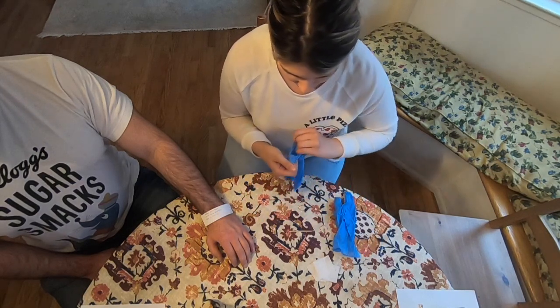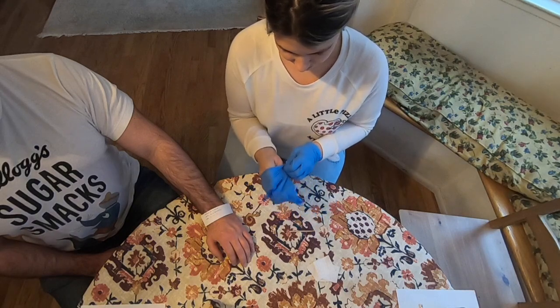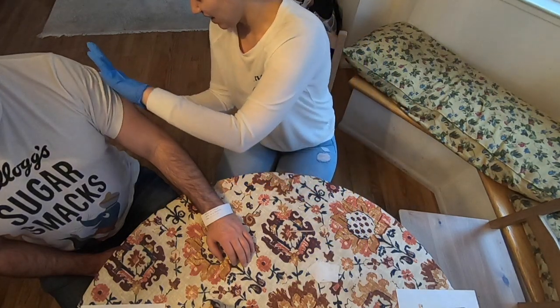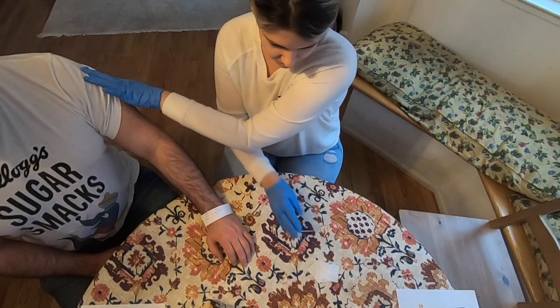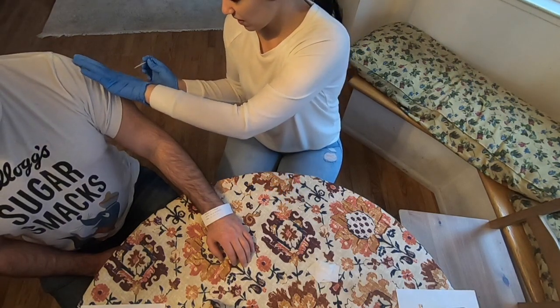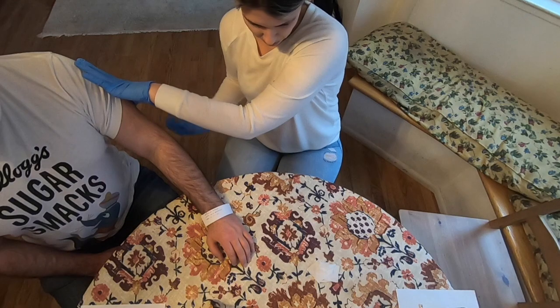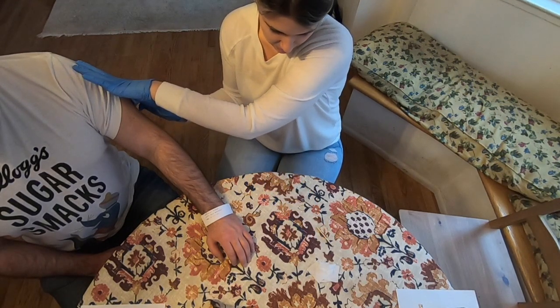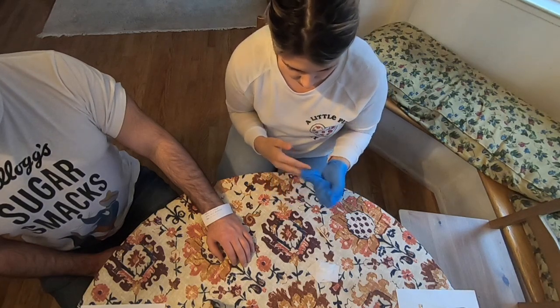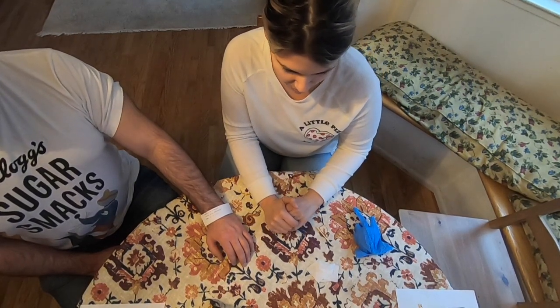My hands have been washed; I'm putting on my gloves now. The patient is in a comfortable upright seated position. I'll take my alcohol wipe and clean the area, let that air dry, remove the cap off my needle, hold it like a dart, insert it 90 to 45 degrees, inject the medication as quickly as possible, apply gentle pressure with gauze or an alcohol pad, engage the safety shield, dispose of the needle into the sharps container, remove gloves, and wash hands.